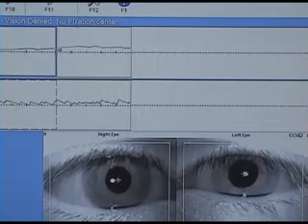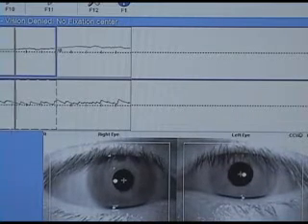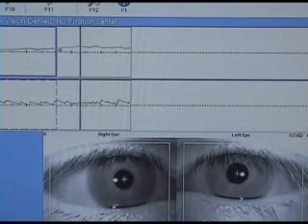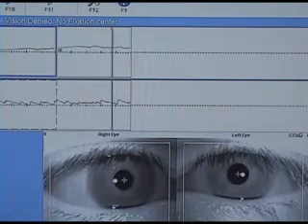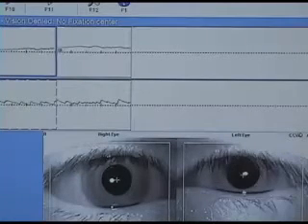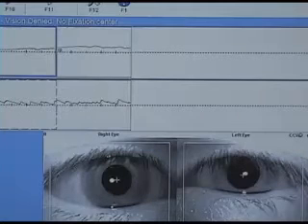See that beating up? That's what we call nystagmus. So this is something that we see. This patient is dealing with dizziness and these types of aspects. So we can help patients with these types of things if we develop specific therapeutic strategies. So that's all for gaze. Let's now move on to pursuits.